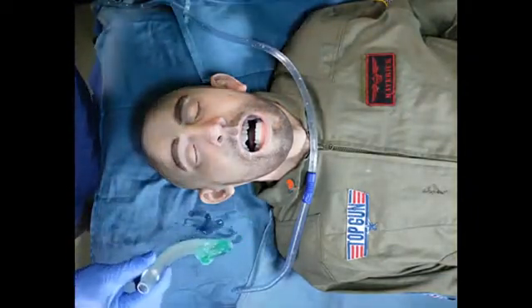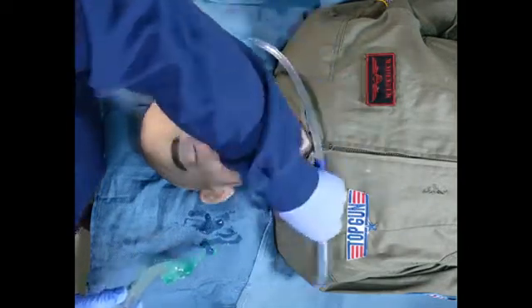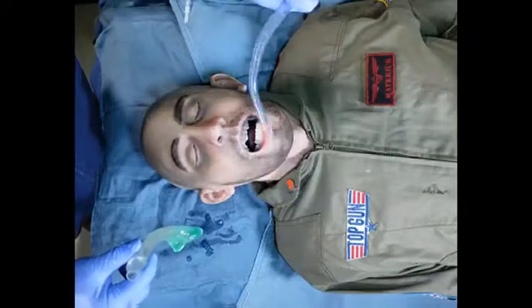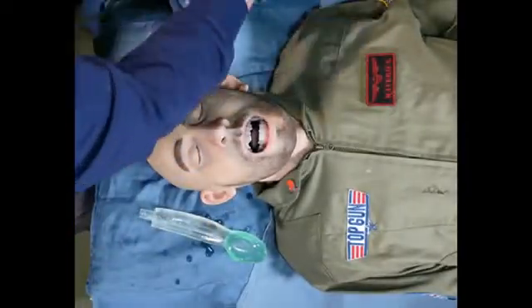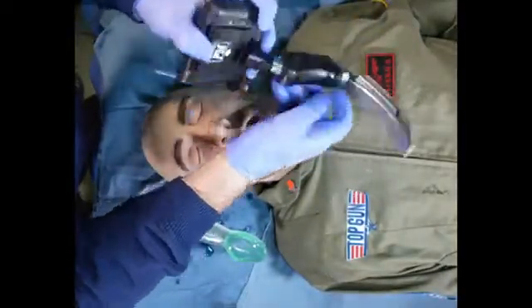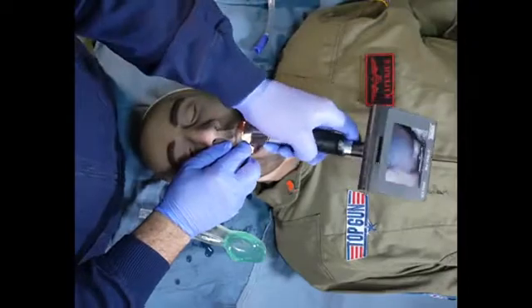We're going to use the suction-assisted supraglottic airway insertion method now, where I hold the suction in my left hand like it's the same shape and contour as a laryngoscope. Push the mandible down, place the suction around the base of the tongue to decontaminate the hypopharynx. And now I'm going to push and lift and place the supraglottic airway. Let's just have a quick look and see how much I've decontaminated already just with that little maneuver. I've decontaminated the hypopharynx. It's pretty dry in there.